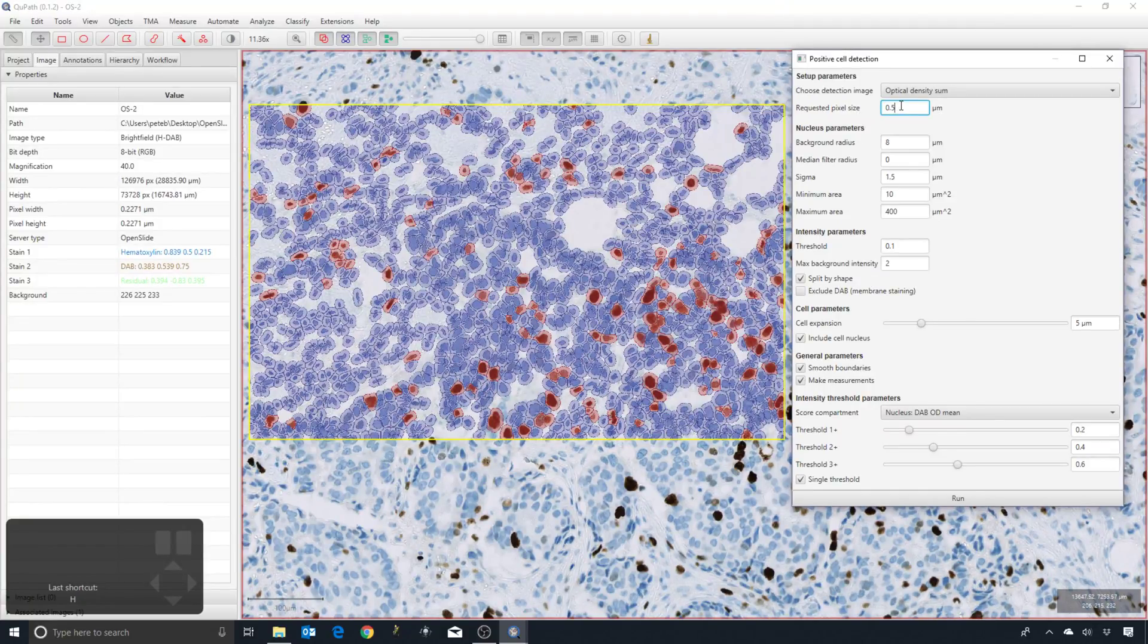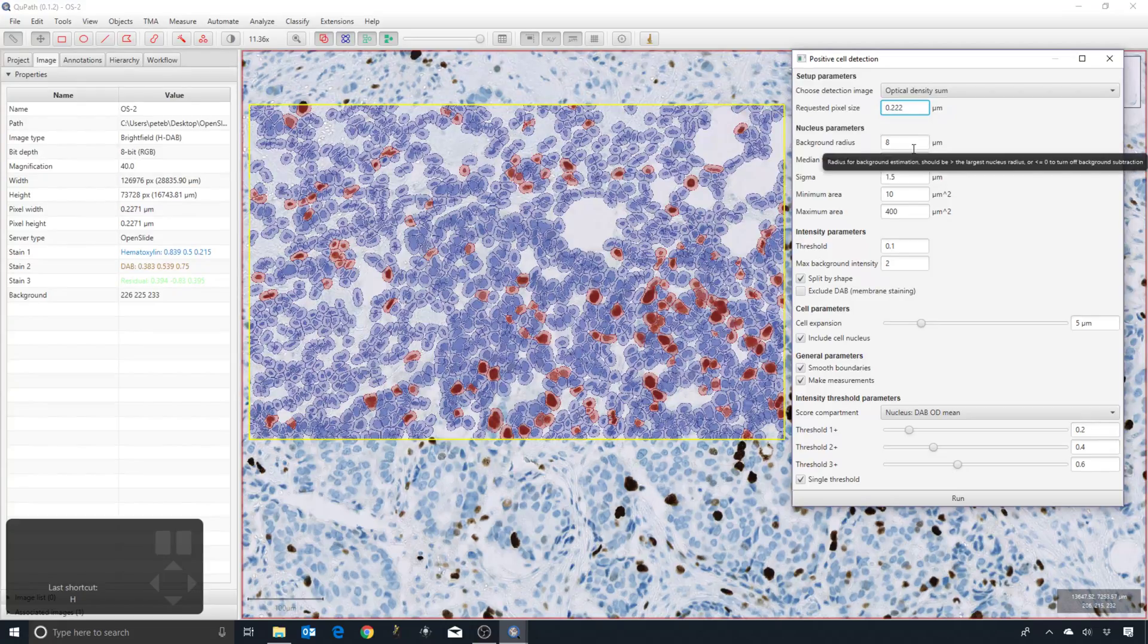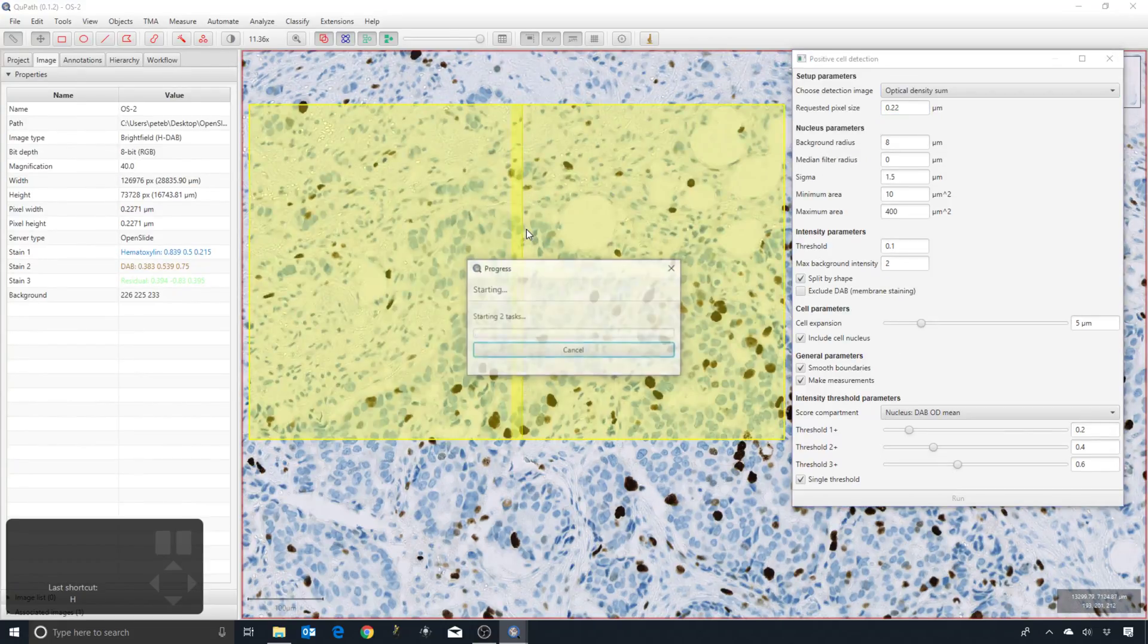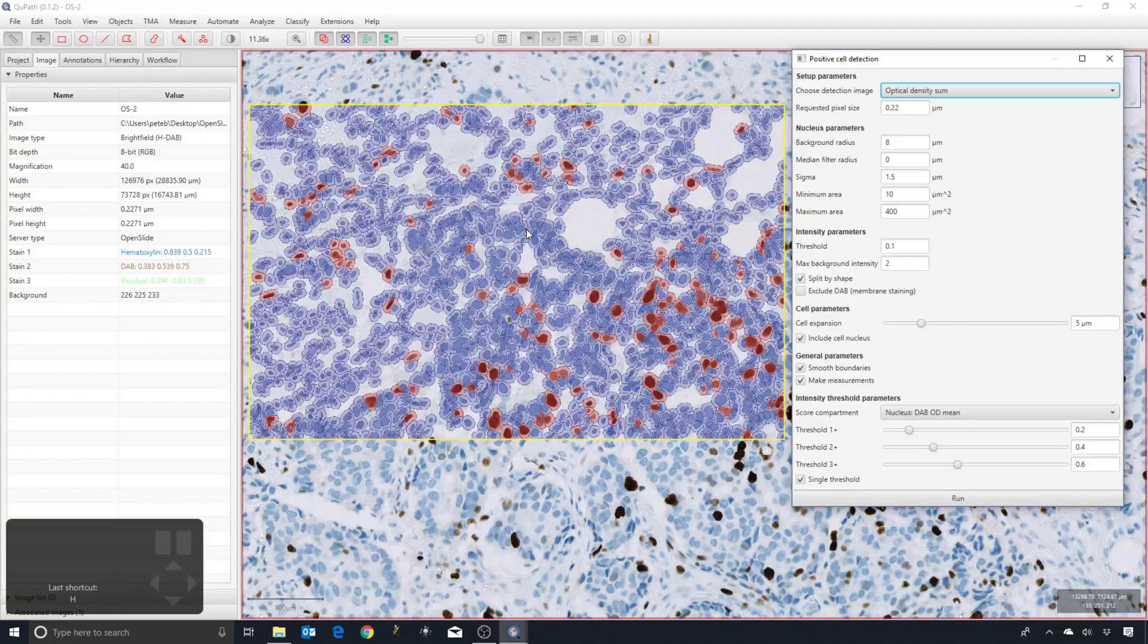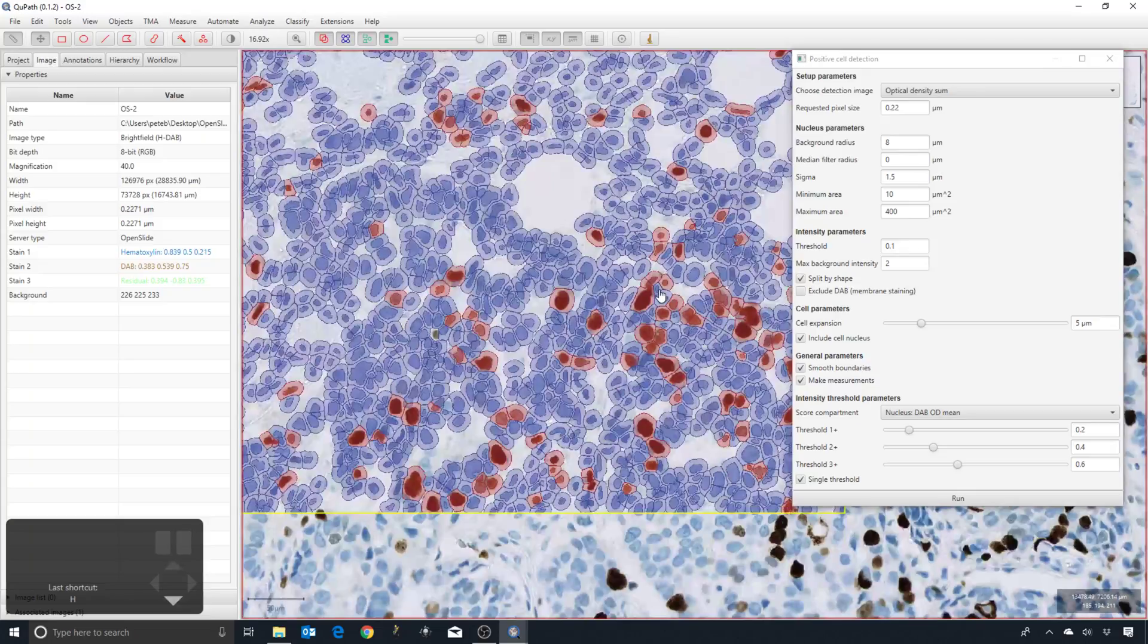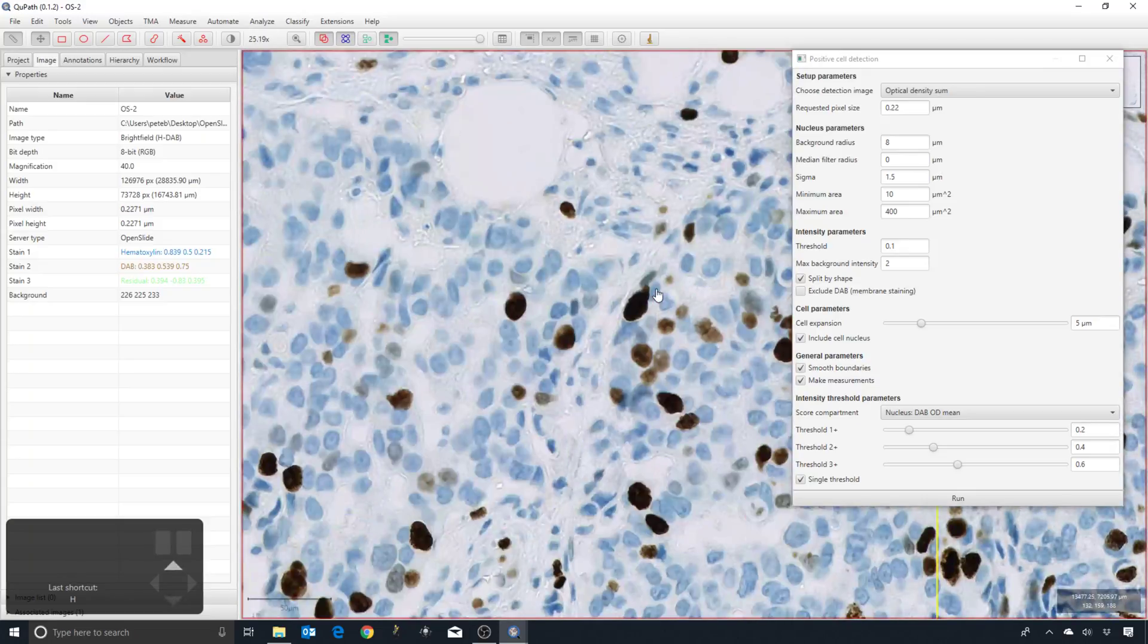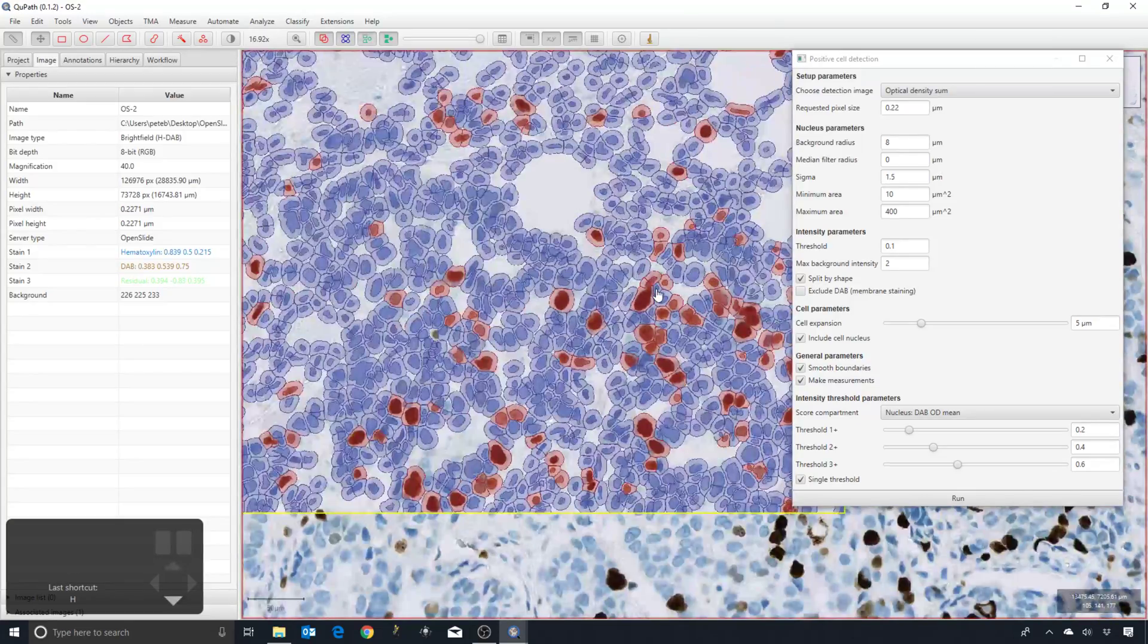If I want to run it at the full resolution image, then I'll type in a pixel size that comes a bit closer to what that resolution is. If I run it, you can see QuPath actually has to divide the image into two because each region is then too large to handle in one go. It will do that in parallel, run the detection, and this is the results that we get.